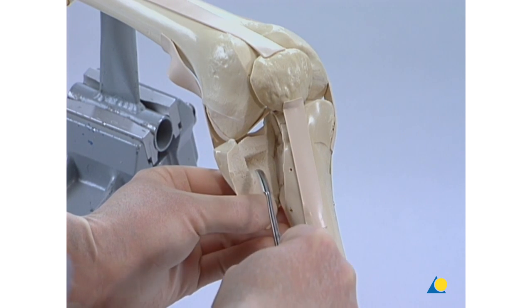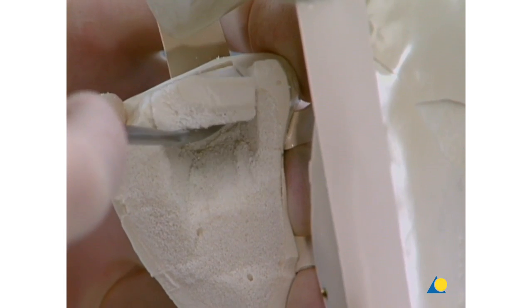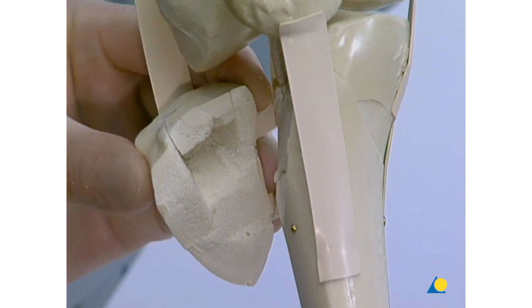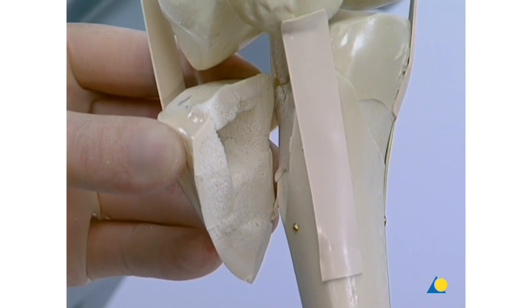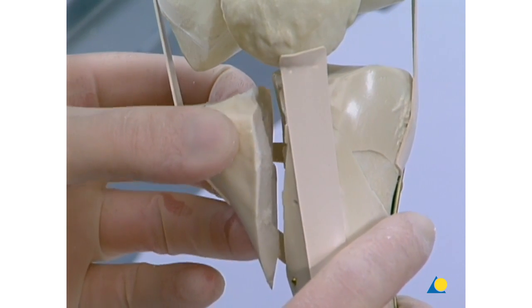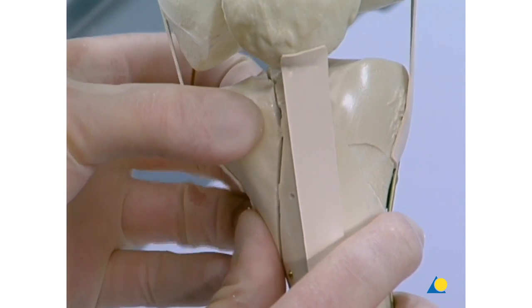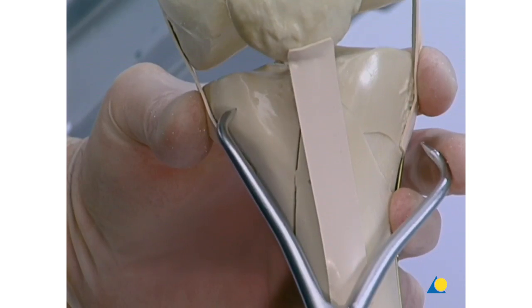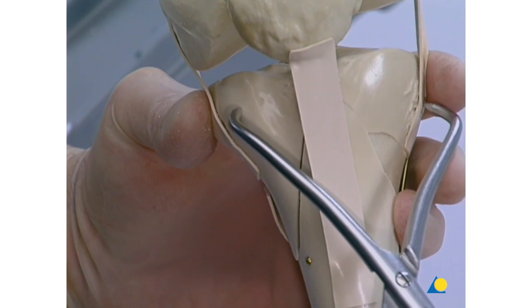The central impaction is elevated with a pusher. After reducing the lateral construct, the reduction is held in place using the large pointed reduction forceps.